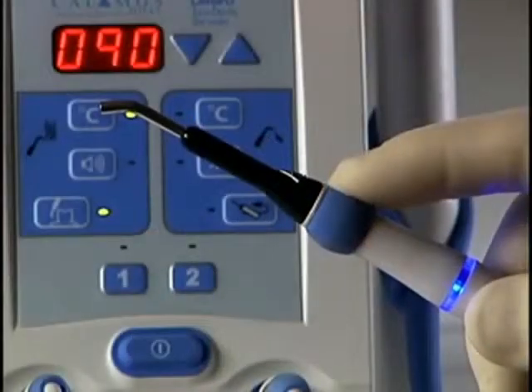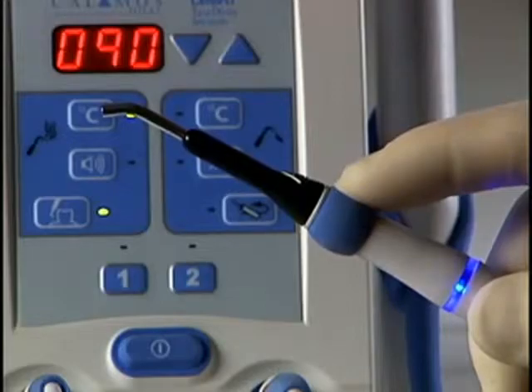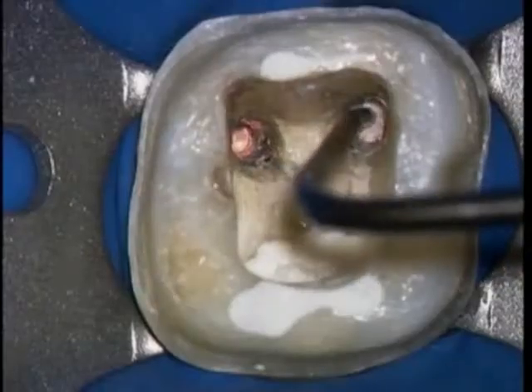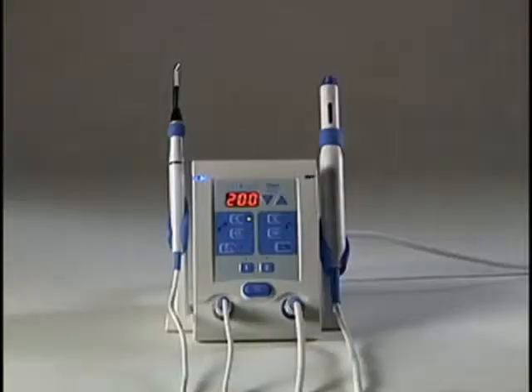To restart after a time out has been reached, release the activation cuff and press again. Do not stay in the root canal space with a heated tip for more than 4 seconds to prevent thermal injuries.